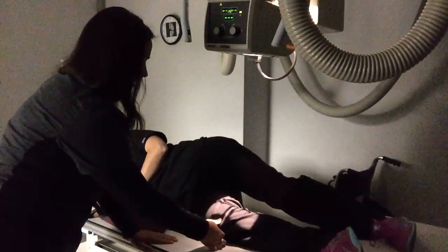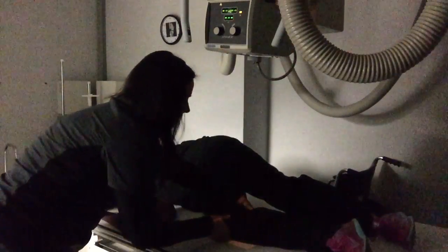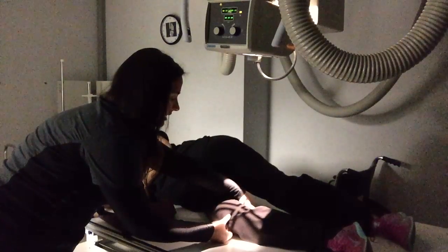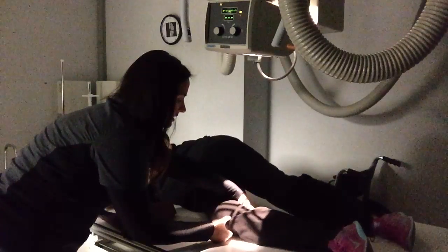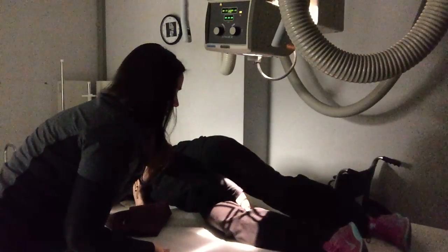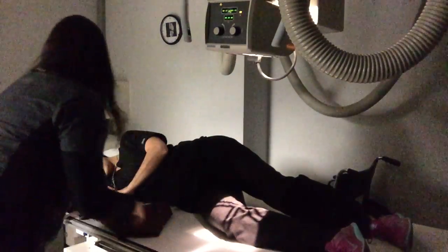Looks like I can't get back to her now, so I'm going to just move her leg back slightly. And I'm going to put a bend in her knee here about 20-30 degrees. And I'm looking to see if her patella is going to be in profile. So you may need to roll their knee down, you may need to roll their knee up. It just depends on their patella. For Mrs. Skaggs, this is in profile. And then I'm going to center just right in the middle here, and you may need to open your collimation side to side. Top to bottom, you should be fine.